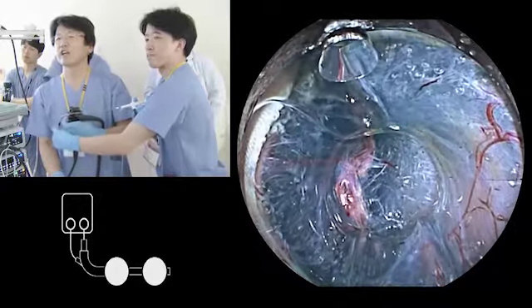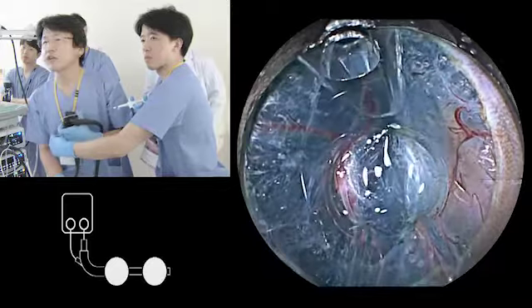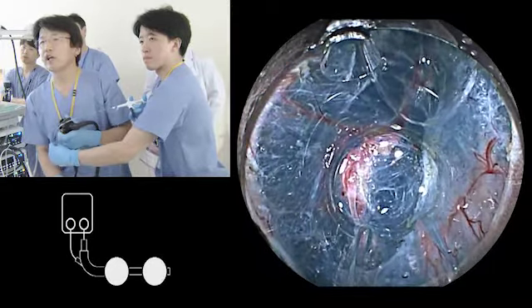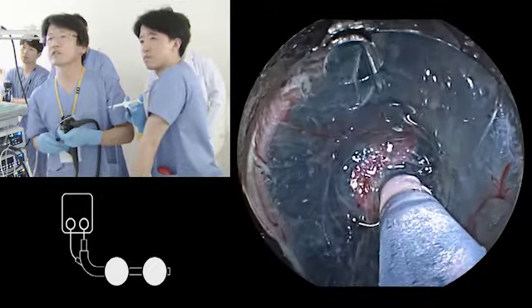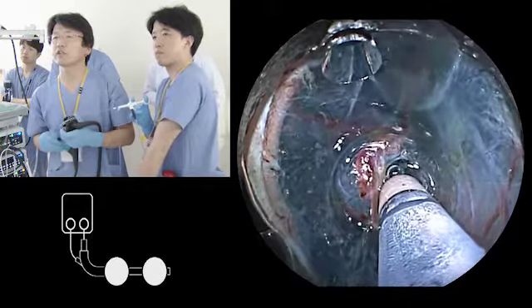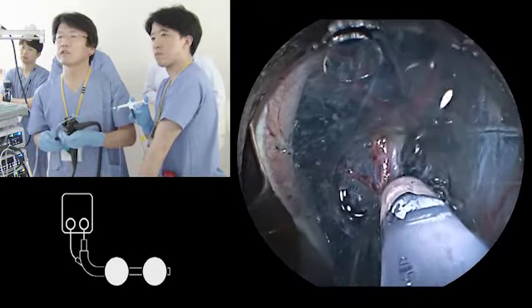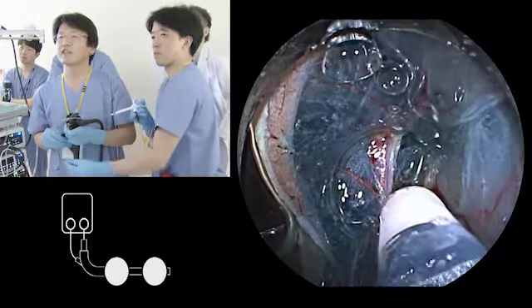So all the blood vessels and all the fat tissue, everything goes up, and you get a very nice clear submucosal tissue. This layer is the layer you want to dissect. Okay?